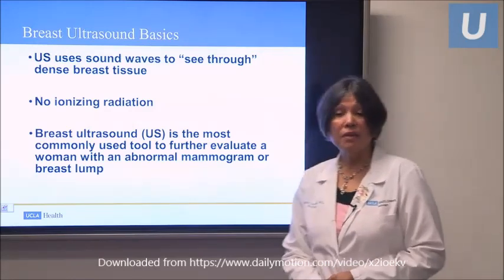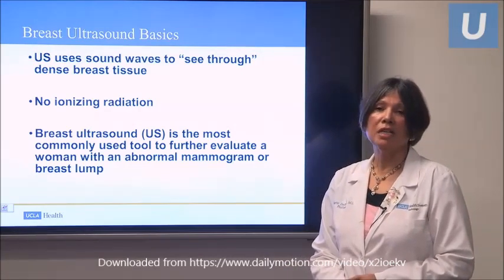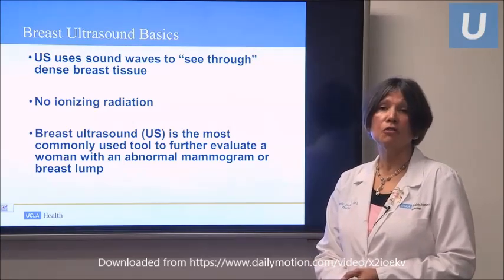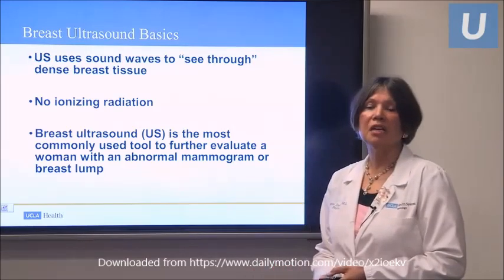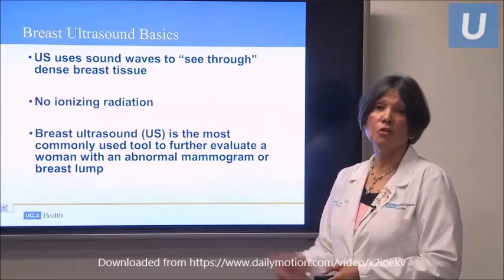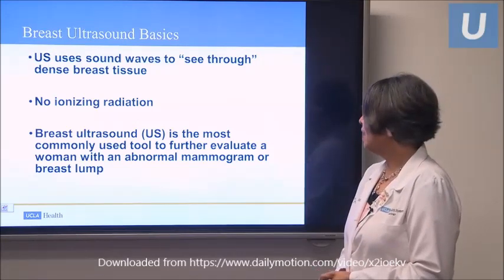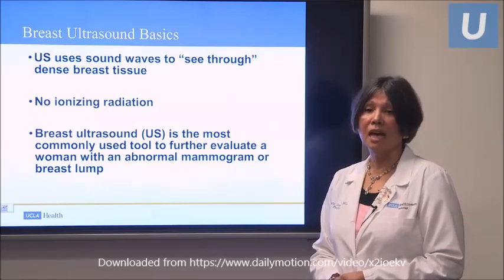Ultrasound uses sound waves to see through dense breast tissue. I tell everyone I compare ultrasound to sonar, which is used in the ocean. Tissue bounces back, you see an image, and if it's water, the beam goes through. There's no radiation, that's an advantage.